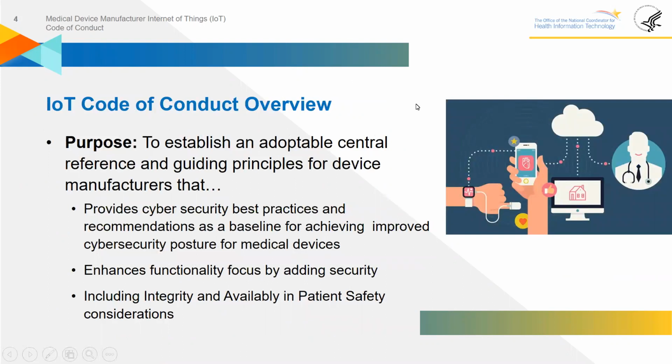The Internet of Things Code of Conduct overview. The Medical Device Manufacturer Internet of Things Code of Conduct was developed by ONC and the Cybersecurity Workstream to address the challenges currently facing medical device security. Additionally, we wanted to address a gap in manufacturer security considerations, both pre-market and post-market.